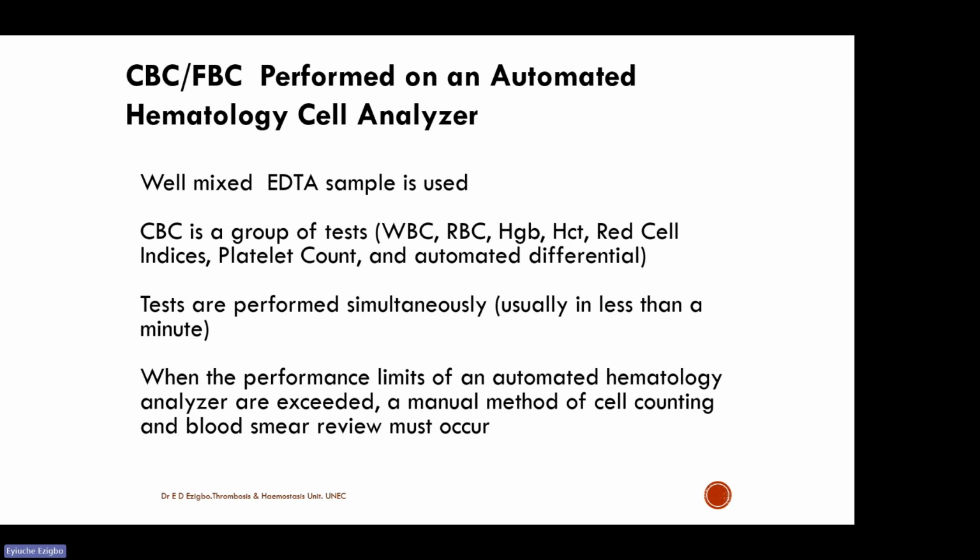So that is why, as a hematologist, you must be able to make your blood film and identify blood cells, because when the chips are down, you still go to make your blood film to be able to know what the machine is flagging. Okay, sometimes.